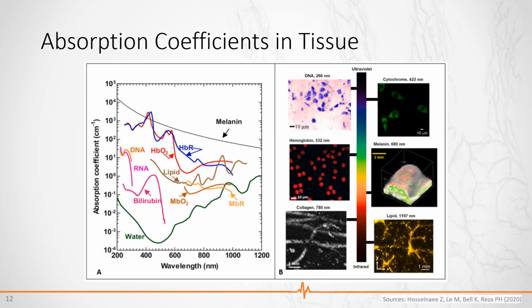In the second figure, you can see examples where PAI was realized for different prominent targets at very different wavelengths, which I find very impressive, that over such a large bandwidth of wavelengths, this technology is useful and used. After this theoretical approach of what targets are feasible, let us move on to the technical realization of imaging devices with PAI.